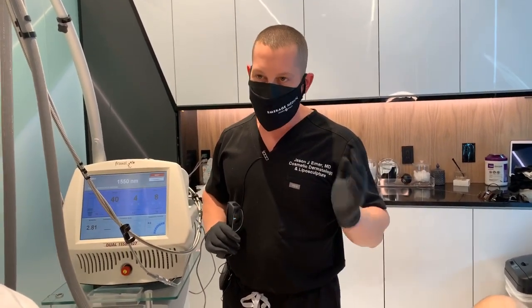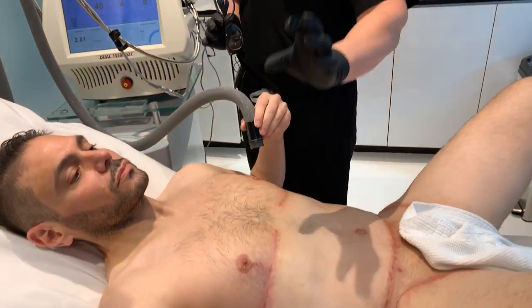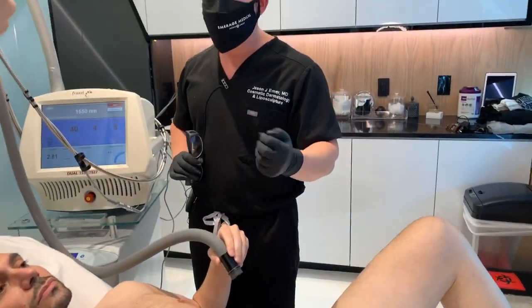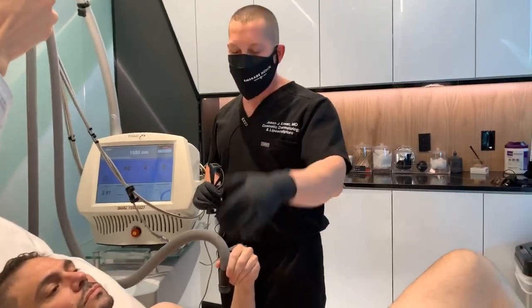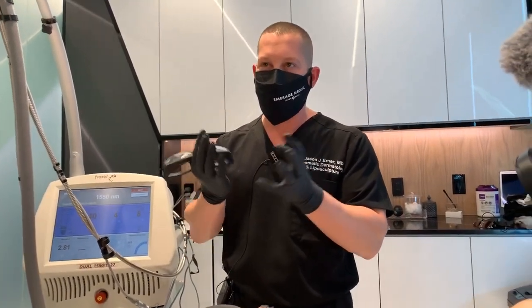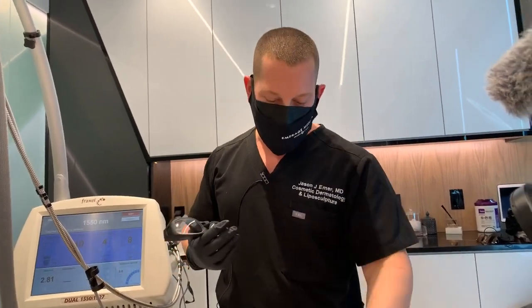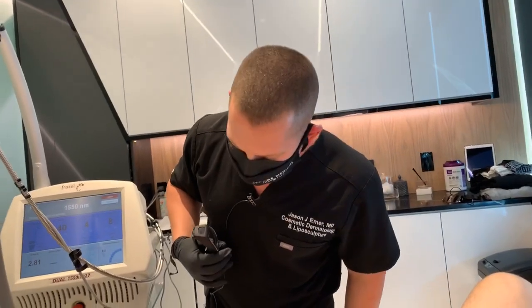And obviously it's very important to go to someone that knows lasers. Scar tissue actually absorbs heat much more than regular tissue. If you did the same energies on a face, you could burn through the scar and worsen the scar. So you have to understand scars. Scars tend to be what I call a heat sink. They'll hold the energy too much. So you really have to know that's why doing this cooling air and doing it properly is really, really important.